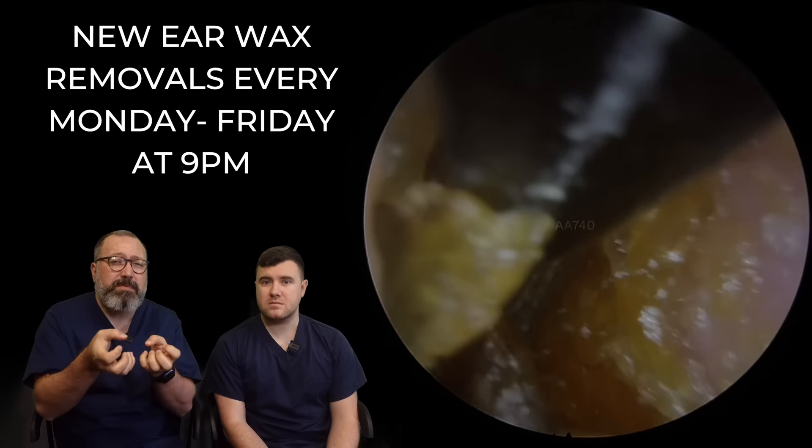Yeah, very keratosis obturans — that's not a word, but it is now. It's almost like the precursor; this would be sort of very early stages of it. And then a bit later on, as this really hardens up, I would say that's more the classic keratosis obturans. We use the onion analogy a lot when we talk about these kind of skin issues, where all the layers are tightly packed together, so we've got to strip each layer out at a time.